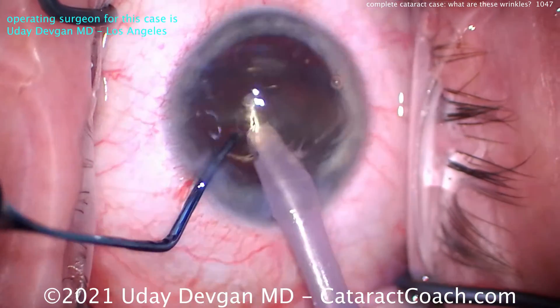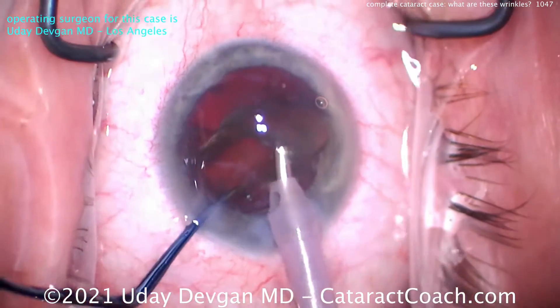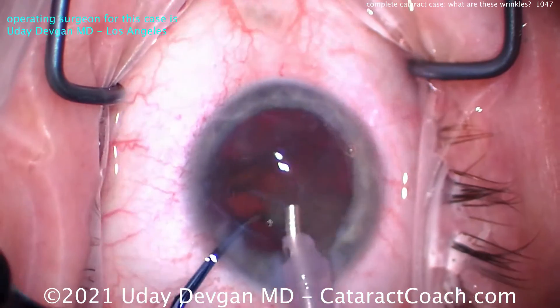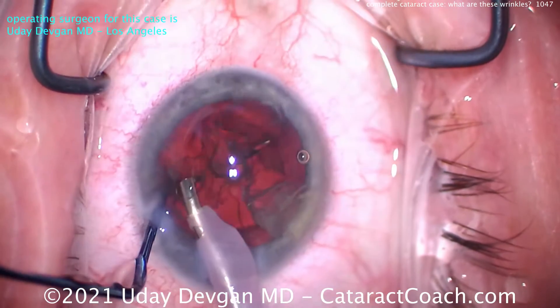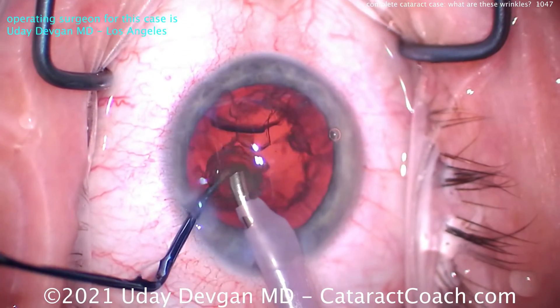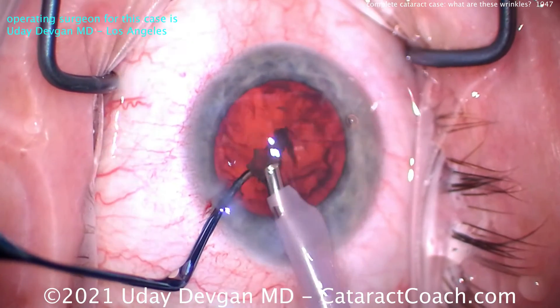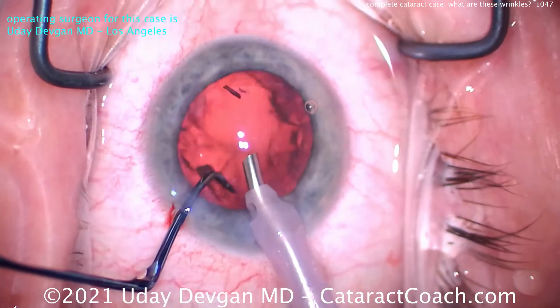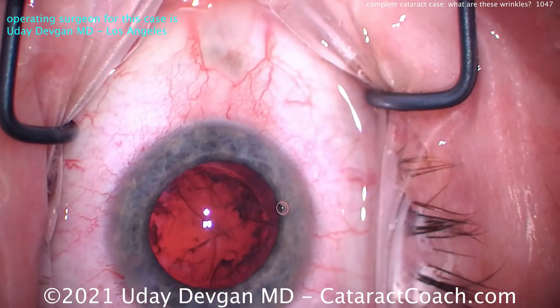Here comes the second half and it doesn't need any more sub-chopping, so I'll just use the chopper to keep the nucleus pushed in front of the probe. A common beginner mistake is too much of the nucleus is under the probe instead of in front of the probe — you want it in front of the probe. Last few pieces going down, chopper in that safety or protective position. You don't want the posterior capsule to come in contact with the phaco tip at all. That looks pretty darn good — time for the cortex removal.